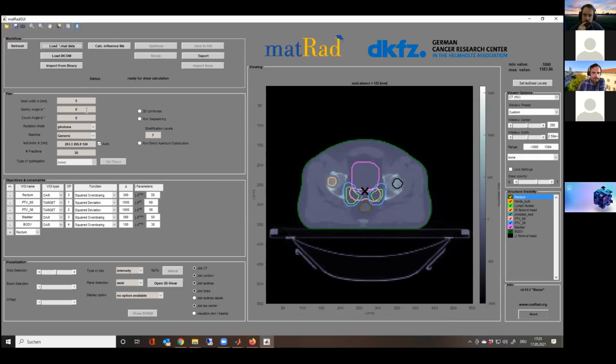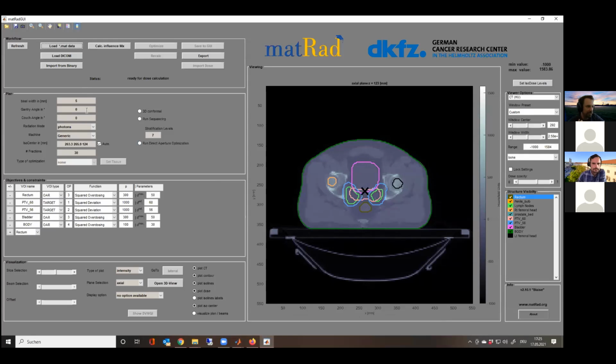So what I would like... Should I quickly show it on Mac? Yes, maybe that's a good idea. Show quickly how to arrive at the user interface, because I'm actually not sure at the moment how the patient files are stored there. So I will stop sharing quickly.